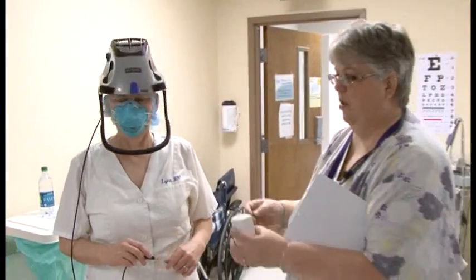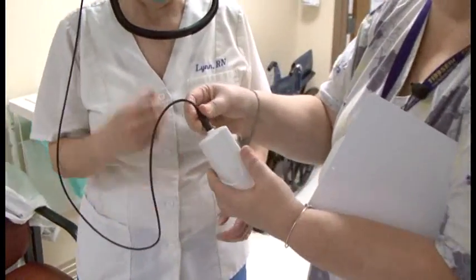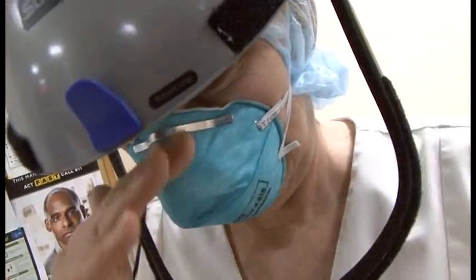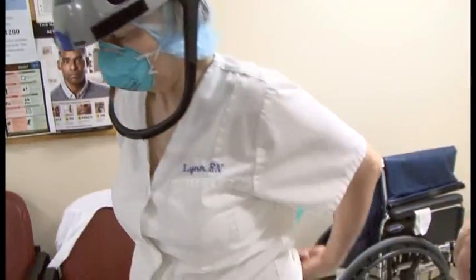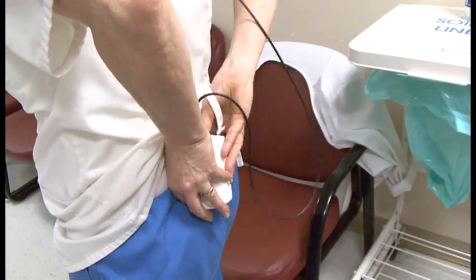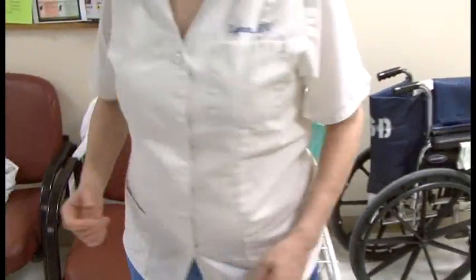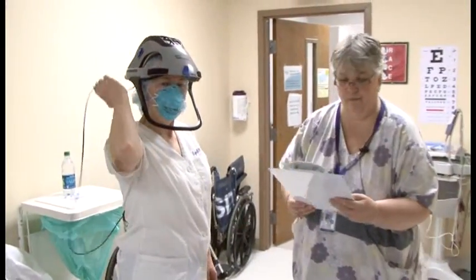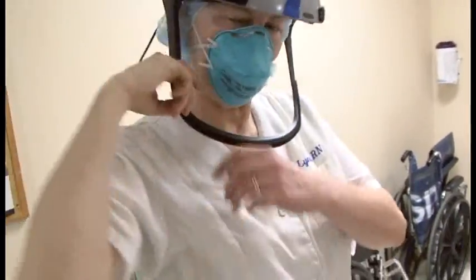Once Lynn has the helmet on securely, the observer connects the battery pack and listens for the fan. Then the battery pack is handed to the donner, and they connect it onto the back waistband of their pants — that's where we found it doesn't fall off when removing the PPE. It's important to make sure the cord is fully behind you.